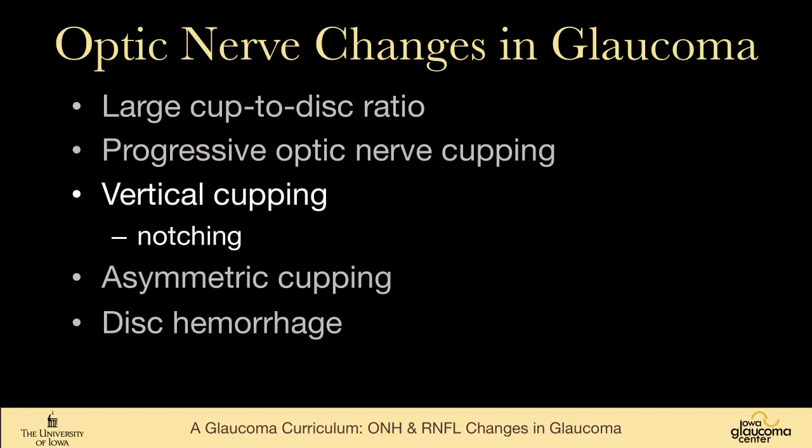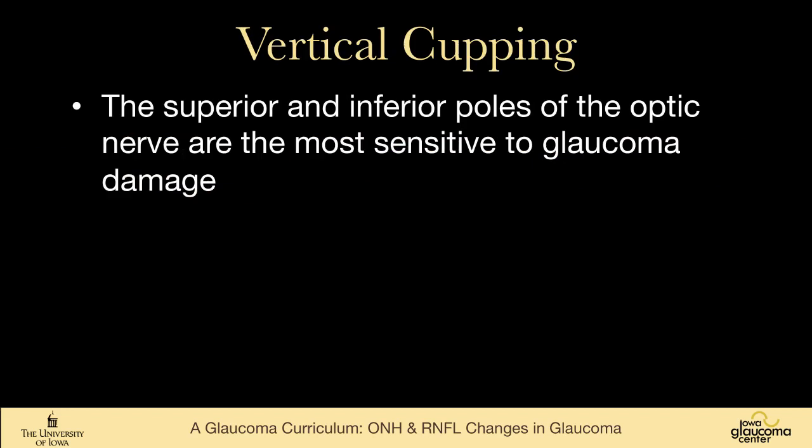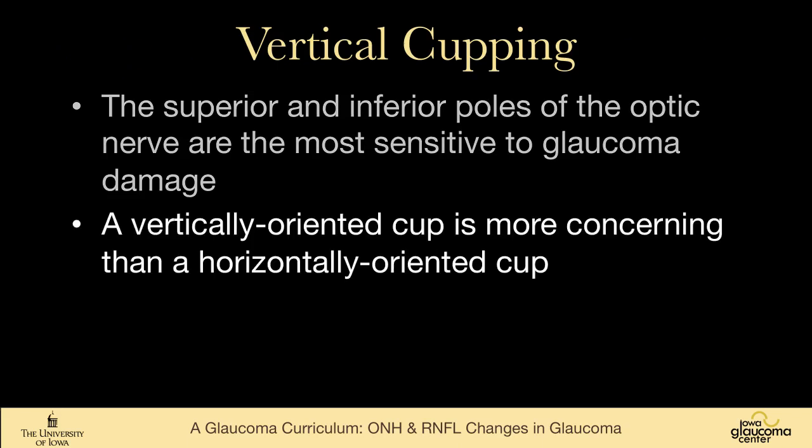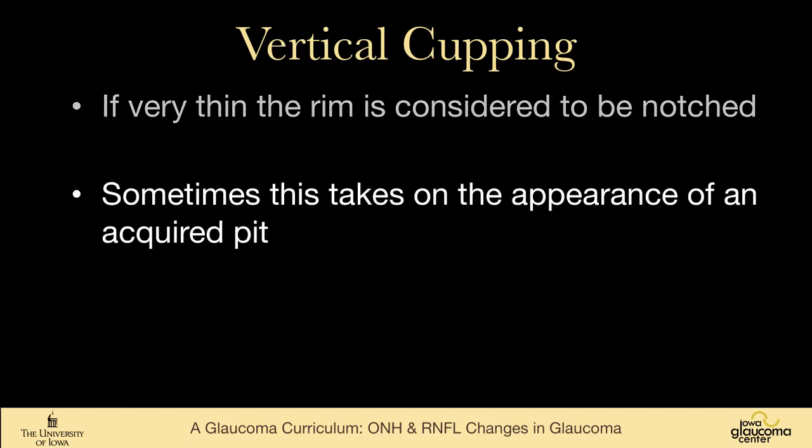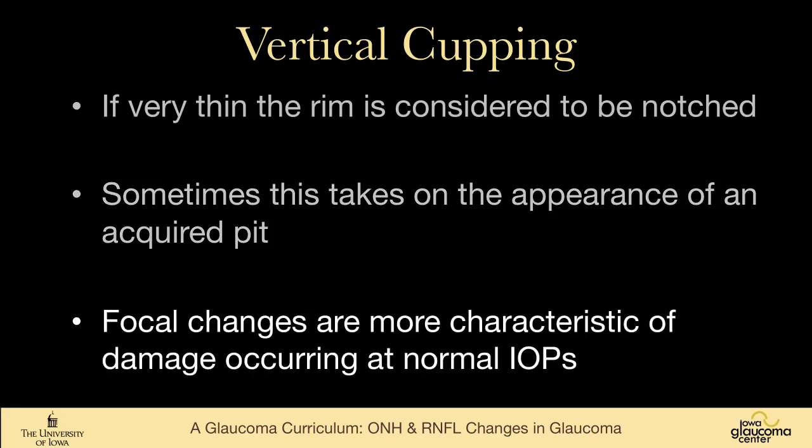Vertical cupping, which can lead to notching, is another sign of glaucoma. So the superior and inferior poles of the optic nerve are more sensitive to glaucoma damage. So a very vertically oriented cup is more concerning than a horizontally oriented cup. If the rim is very thin, then it is considered to be notched. Sometimes this takes on the appearance of an acquired pit, a term that I don't particularly like, but to me just means a very deep notch at the pole of the optic nerve.